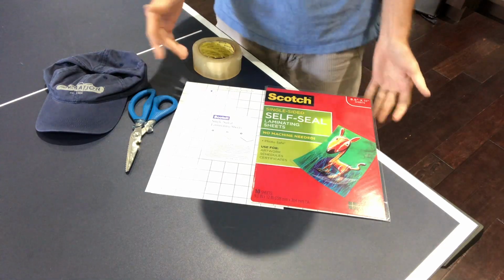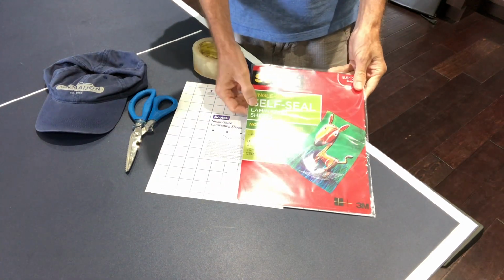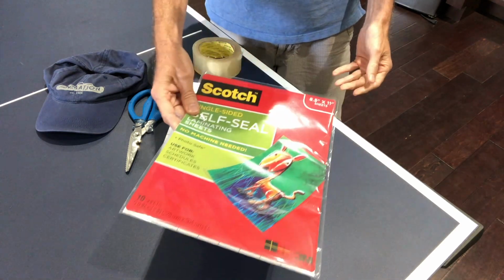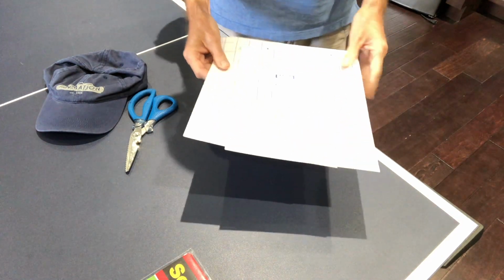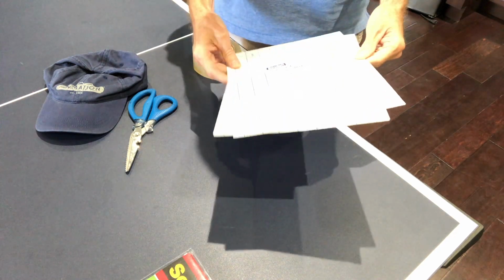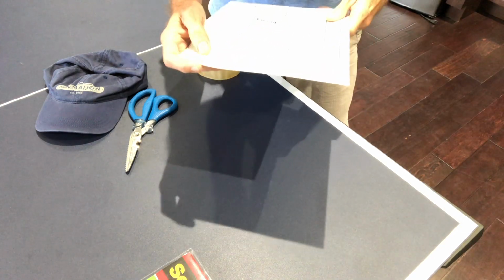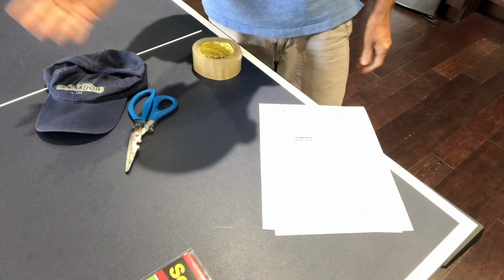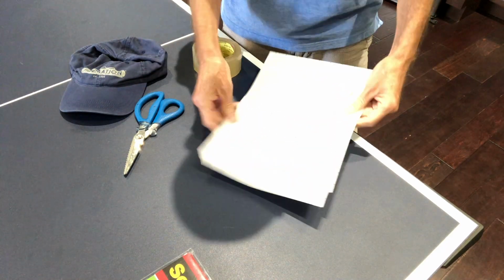All right, so here is what we are going to work with this morning. It's some laminate sheets. This one happens to be Scotch. We're going to take two of these sheets because one side is sticky, so we're going to put the sticky sides together, and they're a little bit flimsy. I think if we get two together, we'll get a little bit of the stiffness that we want. Some tape, that, and the scissors. So let's just go for it here.